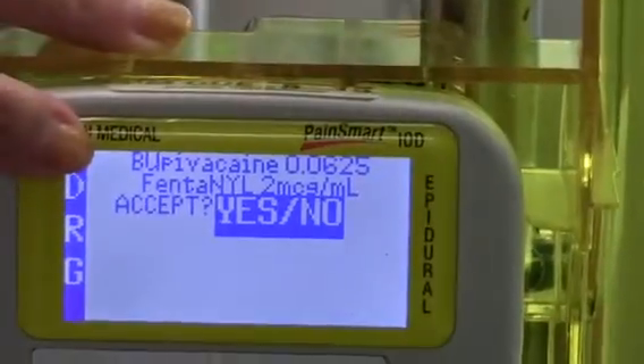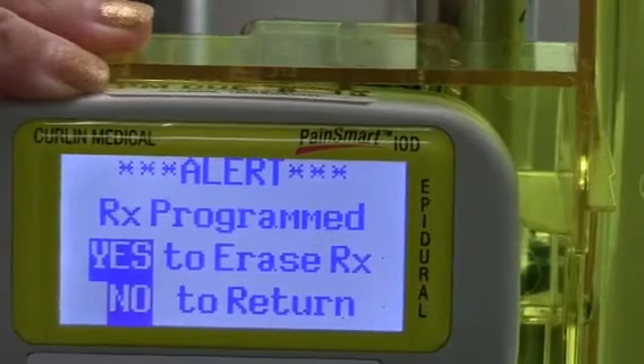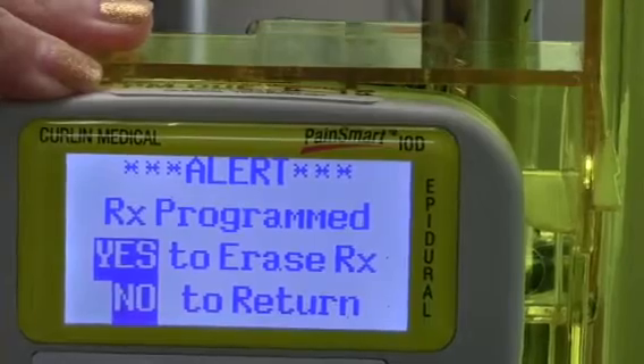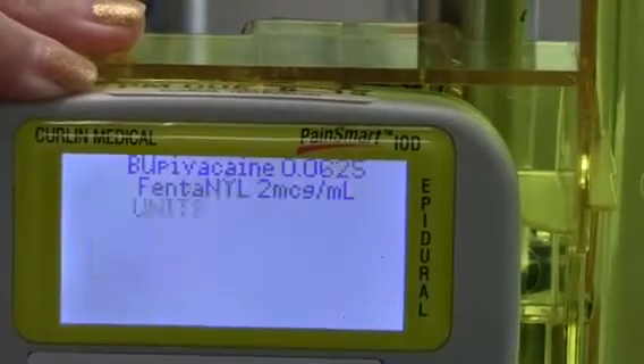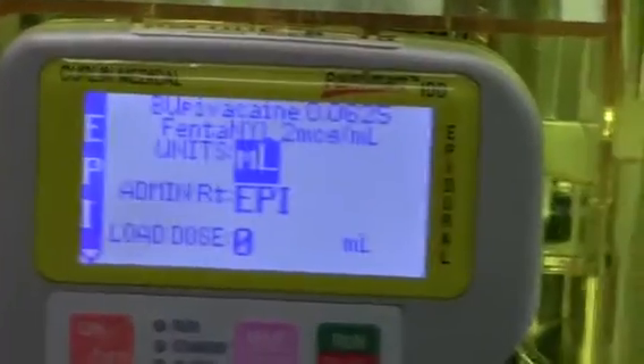We'll accept by saying yes, and it will ask you if you need to erase the previous prescription, and you would say yes. At this point, we're ready to program our pump.